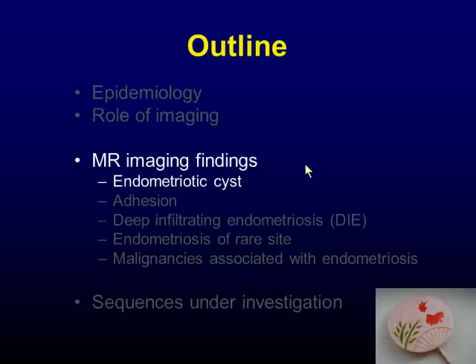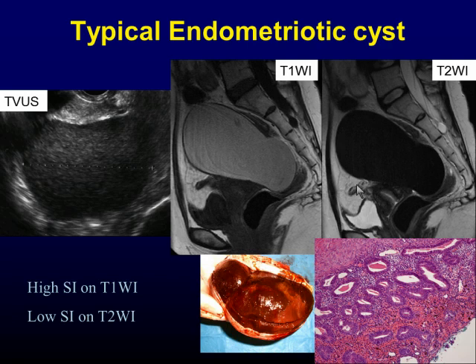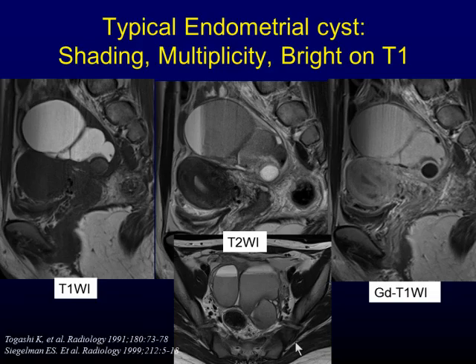Let's move on to the MRI imaging findings of endometriotic cysts. This is the case of typical endometriotic cysts. Typical ultrasound findings are the cystic mass with low internal echoes, sometimes accompanying septations. MR imaging findings are cystic lesions with high signal intensity on T1-weighted image and low signal on T2-weighted image, reflecting the blood product. An important and common feature of endometriotic cysts is shading on T2-weighted image. Shading is caused by chronic bleeding with high concentration of iron and blood within the cysts.